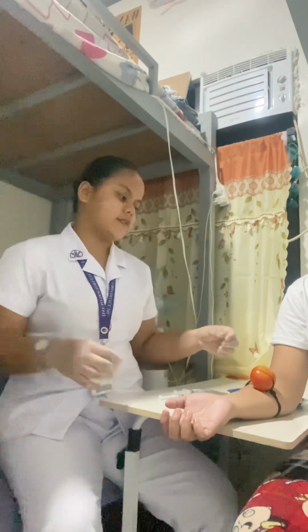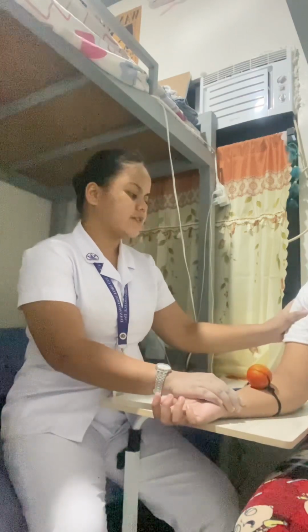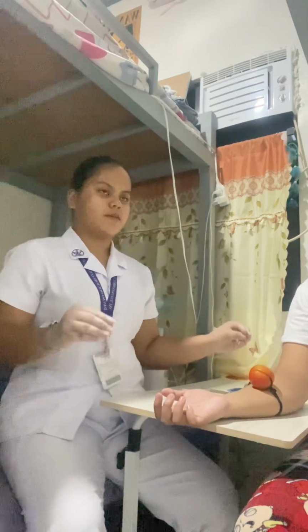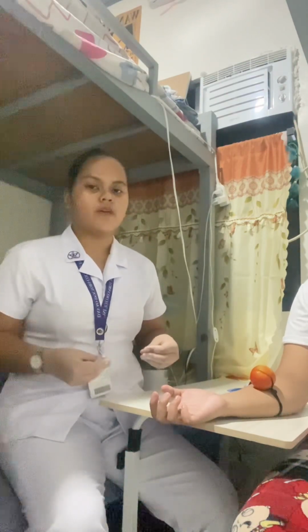So, after verifying the client's identity, I will now assist the client into a comfortable position. This is to make sure that they're comfortable while doing the procedure. So, ma'am, I need you to relax your arm and relax in sitting there. If the client is uncooperative, we also have to pay extra attention in assisting the client. This is to prevent any injuries from occurring.